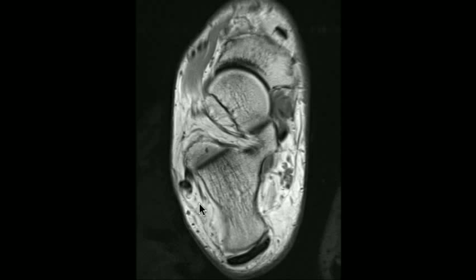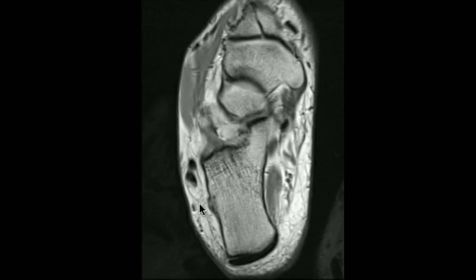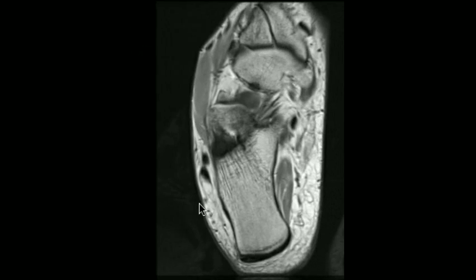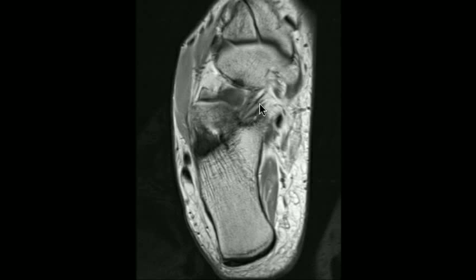Along the medial aspect of the ankle joint is the medial deltoid ligament. This is generally not well evaluated on axial images and is best seen on coronal acquisitions. One other ligament that we can generally see on axial acquisitions is the so-called spring ligament, or the calcaneonavicular ligament. This is located further distally and is identified as a linear structure extending from the anterior aspect of the calcaneus to the medial aspect of the navicular bone, and should be continuous and taut.